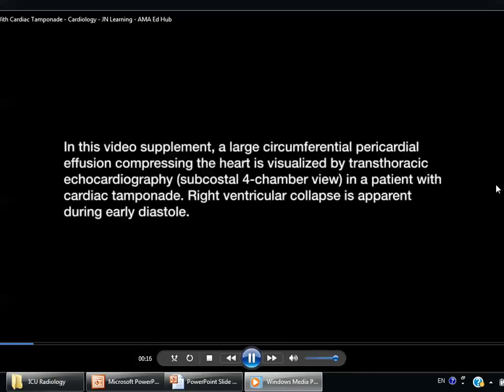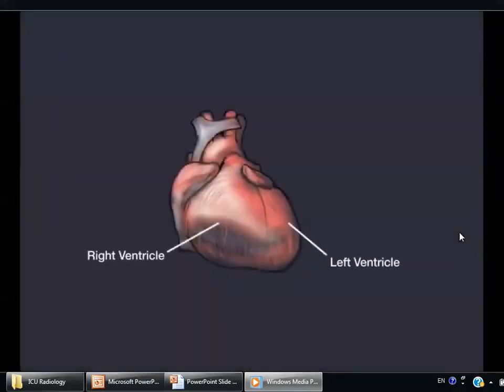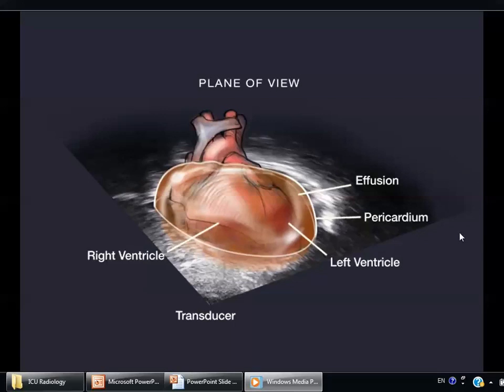So you know that ultrasound is a portable machine that can go to the patient in the ICU. It does not use ionizing radiation and needs no preparation, and also has the Doppler facility, and it is relatively of low cost compared to the other imaging modalities like CT and MRI.